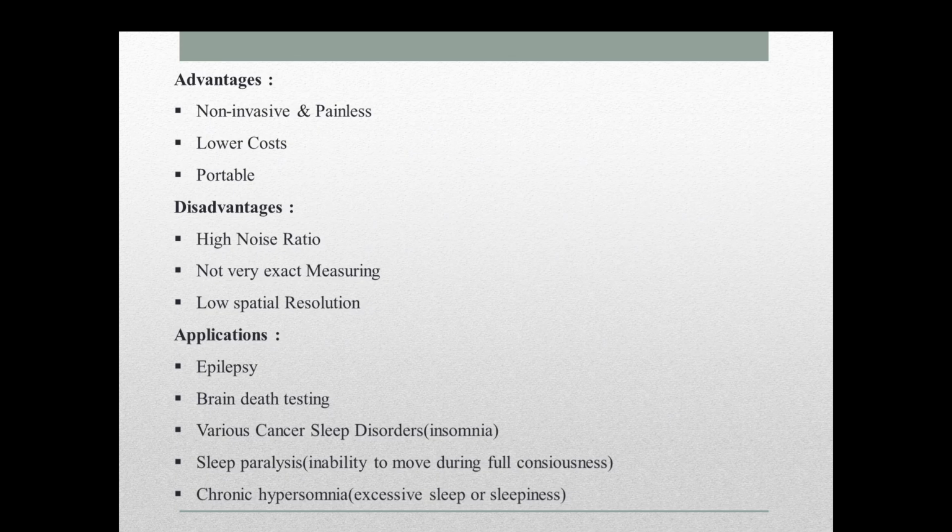Next, finally, we can see the advantages. It is non-invasive, meaning it is not introduced into our skin, and it is painless, it has lower cost, and it is portable. We can carry it anywhere easily. And the disadvantage is the high noise ratio. There will be noise, which is why we use filters, but beyond that we still have a high noise ratio. And it is not very exact in measuring. It will have less resolution, okay. It won't give any exact measuring.